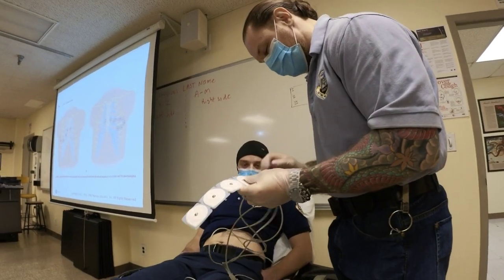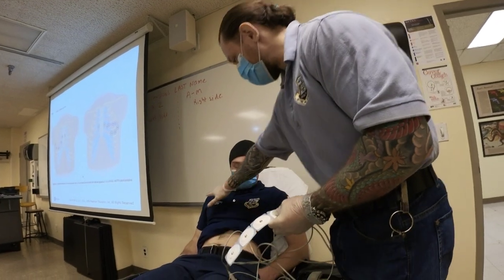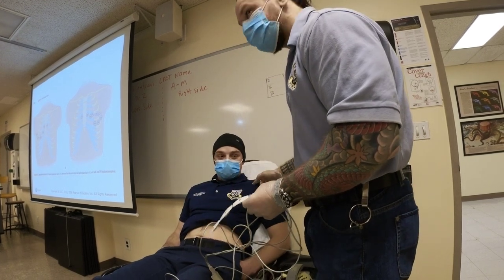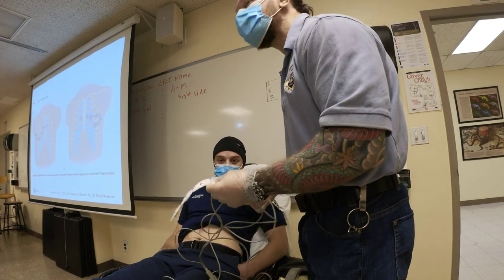I'm not sure. So we're going to go color-coded, right? The way I remember is if I'm looking at the patient, salt, pepper, ketchup, relish. Salt is what color? White. Pepper? Black. Ketchup? Red. Relish? Green.